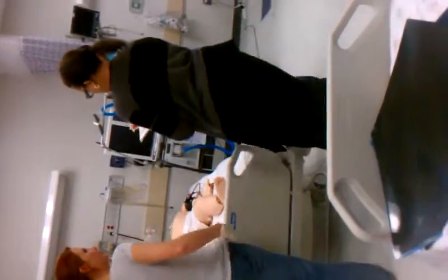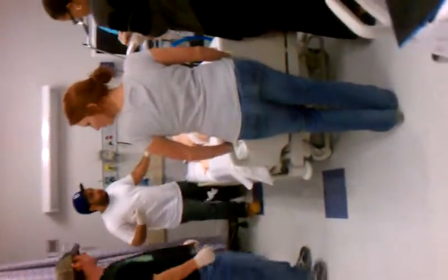Oh, you got it, Rose? All right, Rose, are you ready? Okay. Now, go ahead and get the ventilator running, and I'll give you the settings.